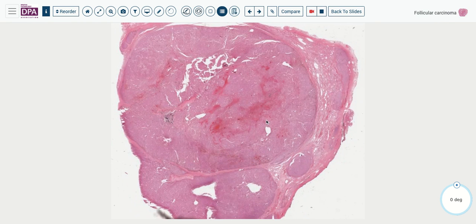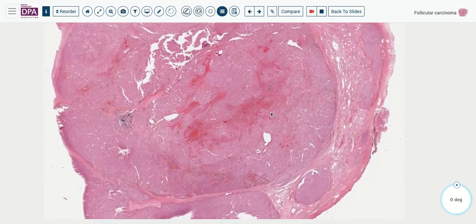Okay, so here's an example of a tumor. We see it here. It has a little bit of a capsule, but we can see that we have extensive amounts of tumor outside the capsule, here. And so we don't need to even ask the question, is this malignant? Is there invasion? Because we see it at low magnification, that there is extension far beyond the capsule.